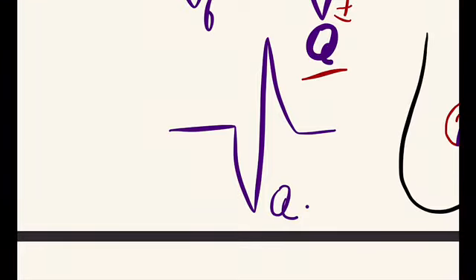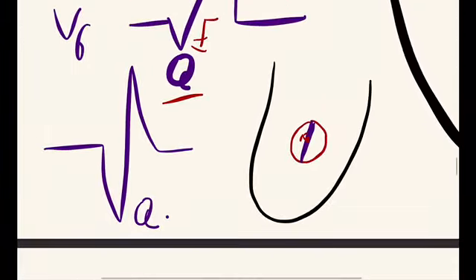If you have not got this point, please ask in the comments or in DM. I will describe it again. So this was the basis behind the abnormal Q wave. So the ventricles are depolarized from now. This was the concept, and one thing you should always remember: the ventricle gets depolarized from inside to outside.